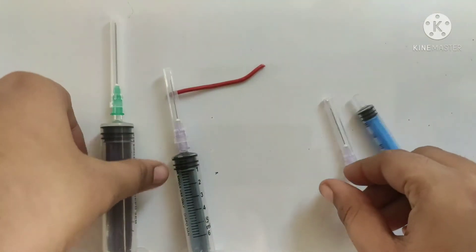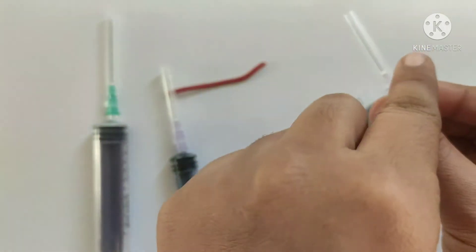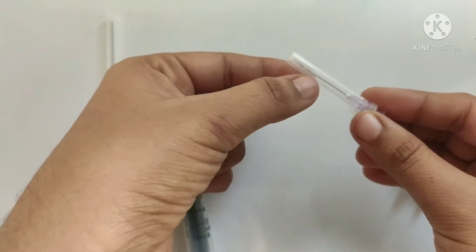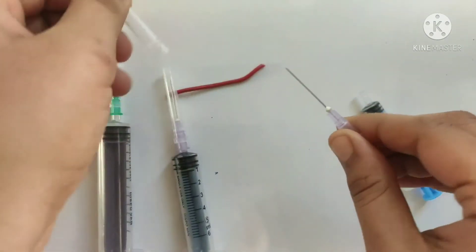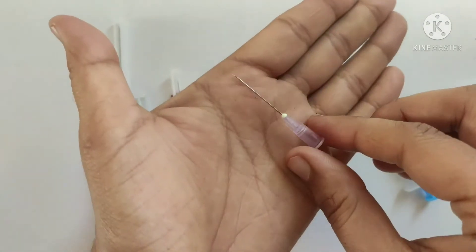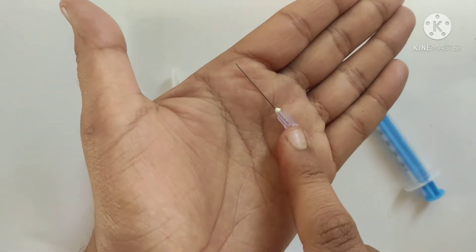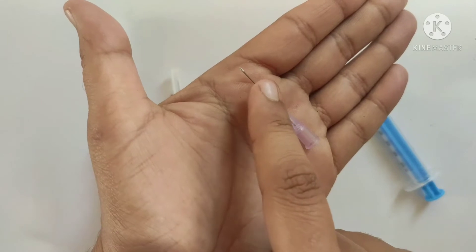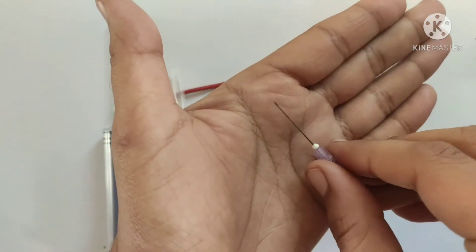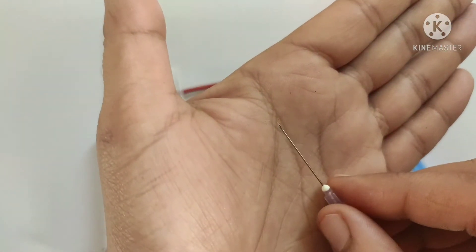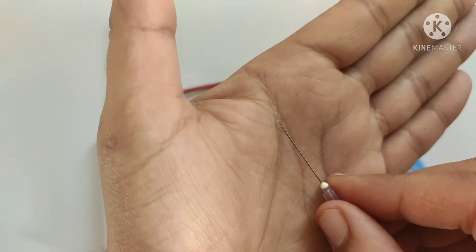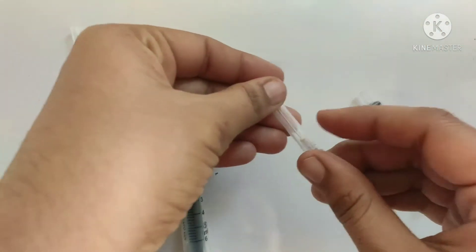Now let's look at the parts of needle. This is known as guard of the needle. Opening it, we get this needle. Now it has three parts: this is the hub of the needle, this is the shaft of the needle, and upper part is known as beveled tip. Now what is the use of this beveled tip?